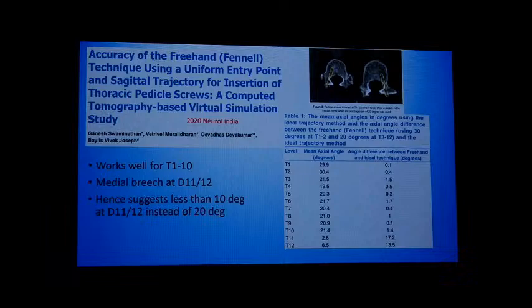Now, the accuracy of this technique was studied by a CT-based simulation technique by Dr. Vivek Joseph and his team here. 240 screws they had simulated, and they checked the ideal angle versus the Fennell angle. So we can see this is the ideal angle, and there was not much difference for T1 to T10. So you can use that very comfortably.